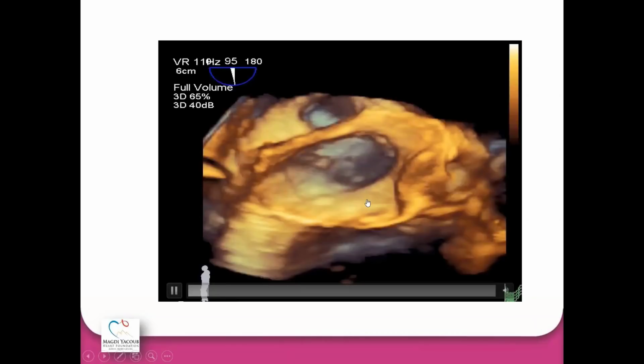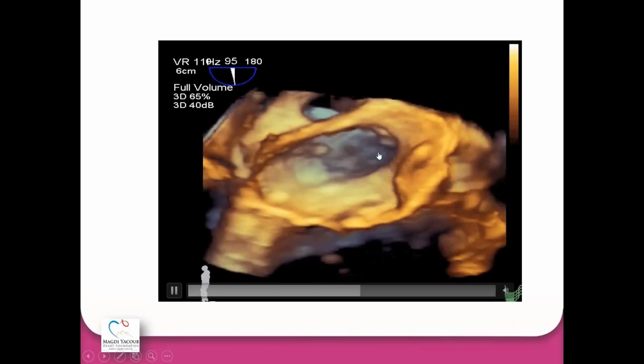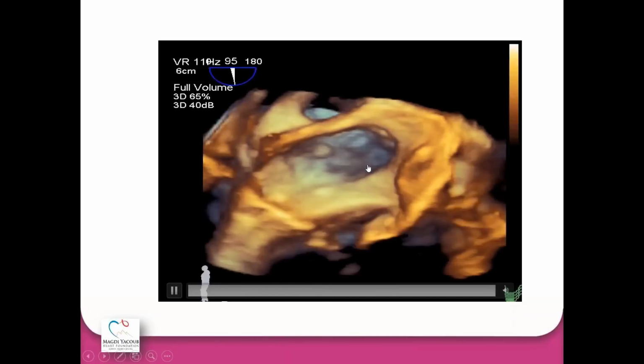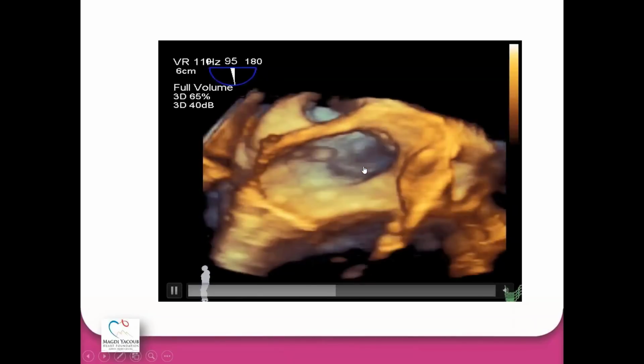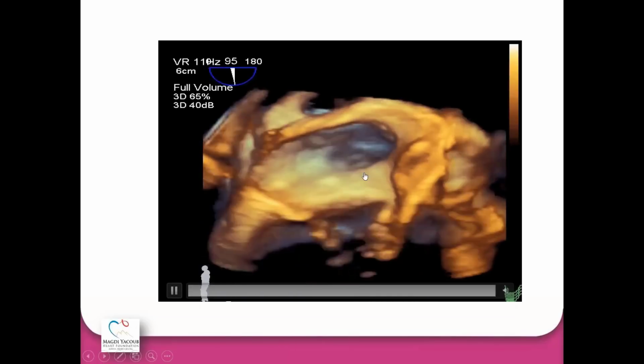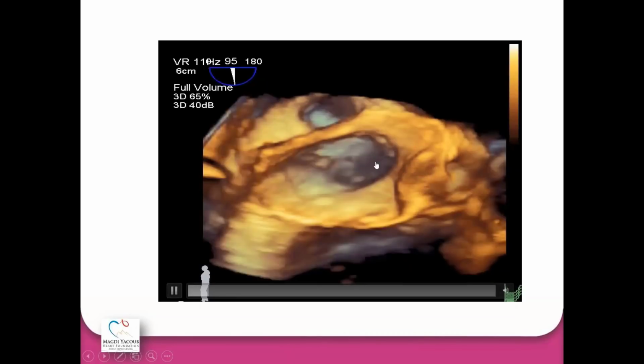Assessment of the left atrial appendage. This is very important. A lot of those patients have atrial fibrillation because they have left atrial hypertension, so they are very liable to have thrombosis inside the left atrial appendage. Assessment of the left atrial appendage and exclusion of the presence of any thrombi inside it is quite important, because the wire, as I said, may accidentally go inside the left atrial appendage, causing dislodgement of any thrombus with its very bad sequelae that we all know, from CVA or strokes.